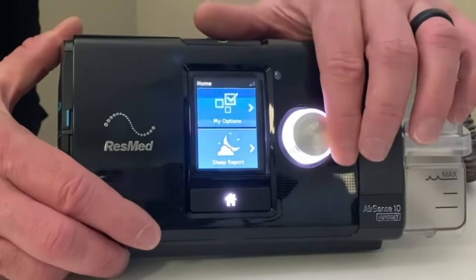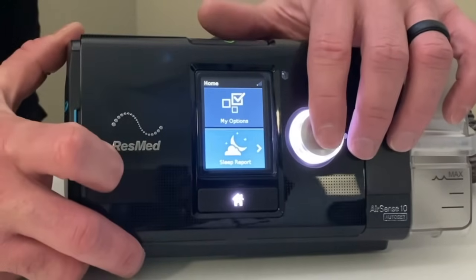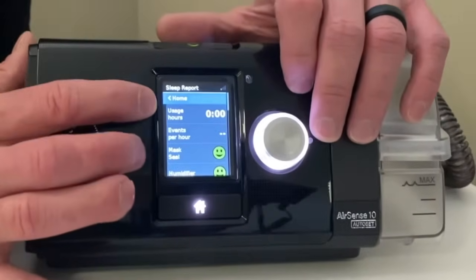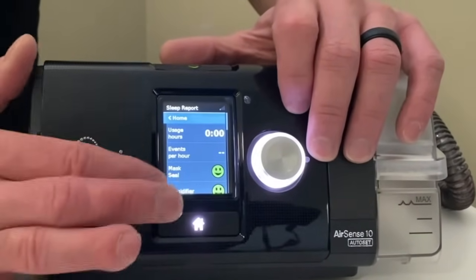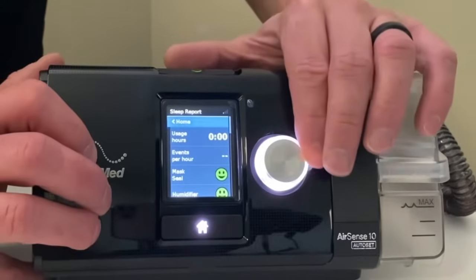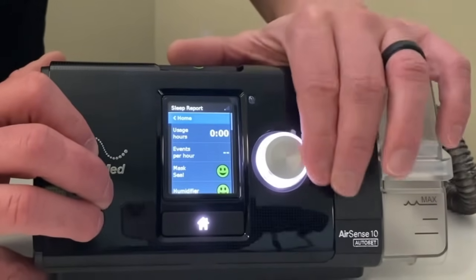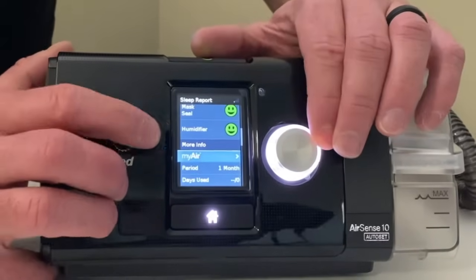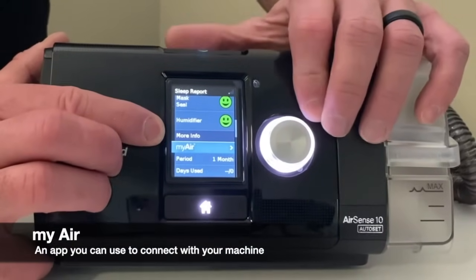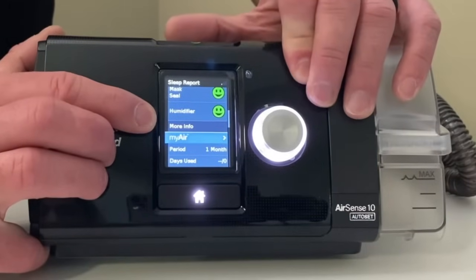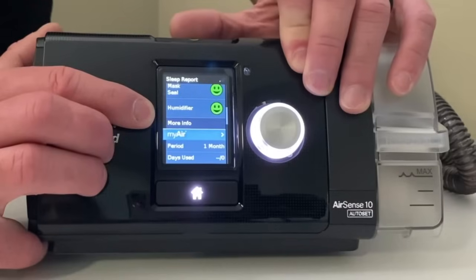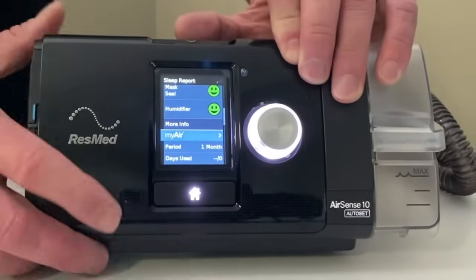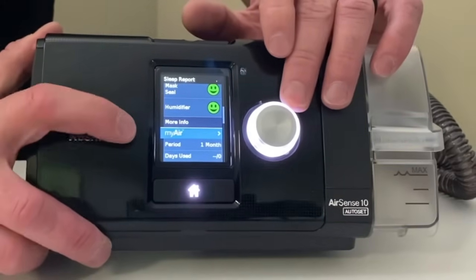You'll notice as I twist it up and down, whatever's highlighted in blue is where you're going to get into. If I click on this, it's going to tell you a quick snapshot of how you did the previous night. Scrolling down, you'll see MyAir — that's an app you can get for your machine. We'll talk about that when we get you set up, and I can send you an invitation via email to get that app if you prefer.